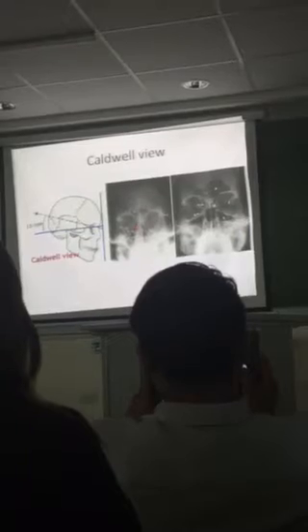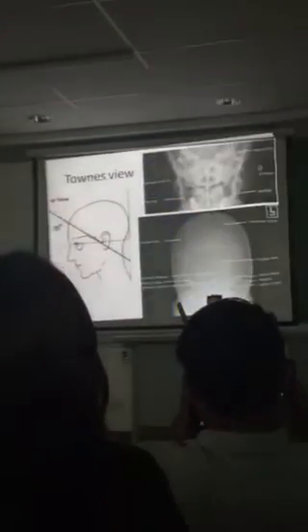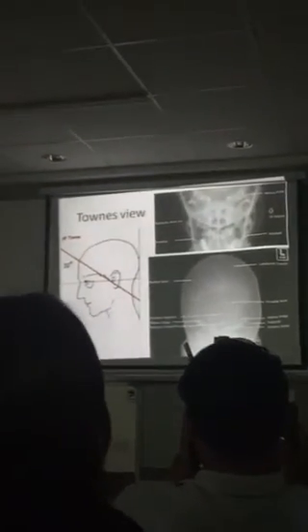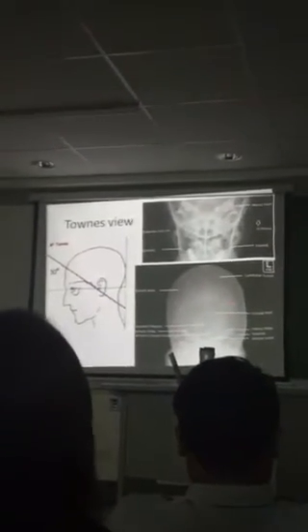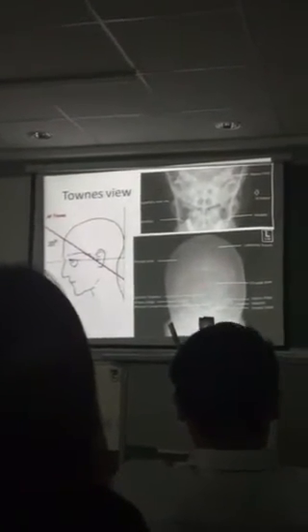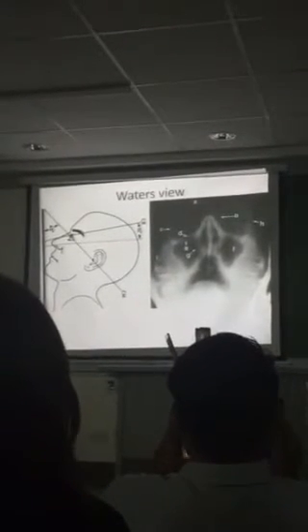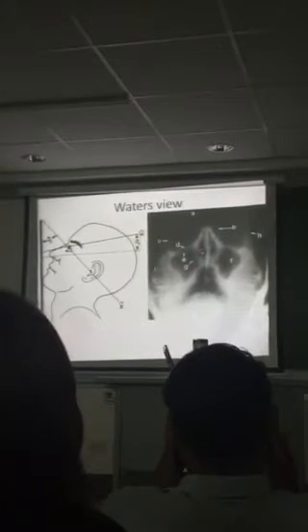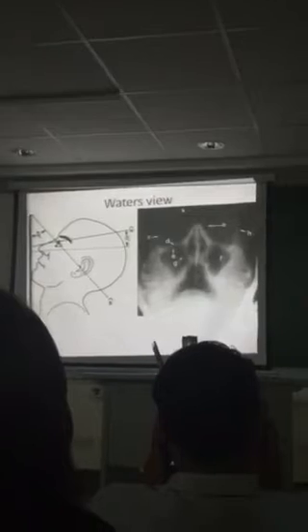This one. There. And then for the Townes view, the focus is on the occipital area. This won't come out. So Waters, the same. Focus on the maxilla, the nasal bone, the orbit.